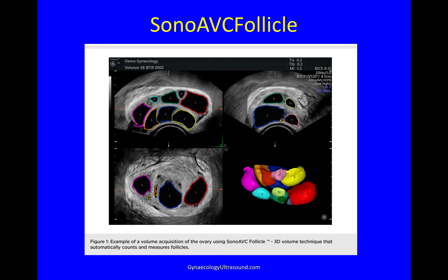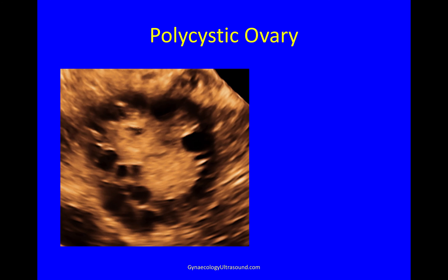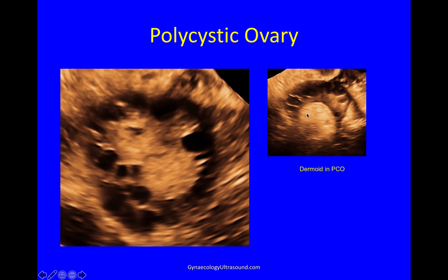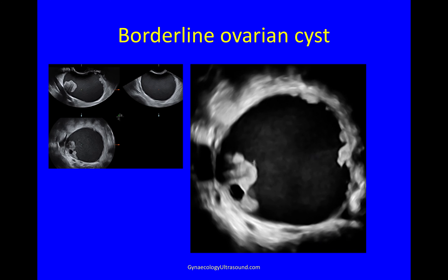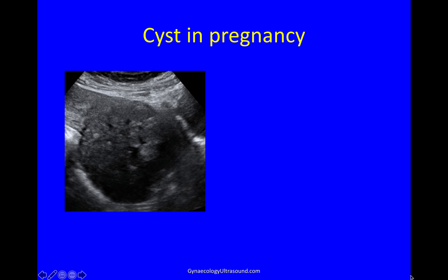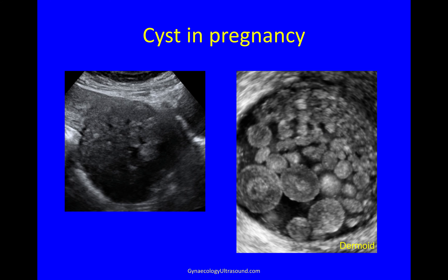3D is useful for antral follicle counting — you can measure and count follicles using SonoAVC technology. This is what a polycystic ovary looks like on 3D ultrasound, with more than 20 follicles visible, giving a diagnosis of polycystic ovary. This is a dermoid in a polycystic ovary. For characterization of adnexal masses 3D is not the primary tool — 2D with the IOTA classification system gives you the answer — but 3D can reveal additional detail, such as in this borderline cyst where a large papillation and widespread wall irregularities are seen. In a case of a cyst in pregnancy, 3D clearly confirmed it to be a dermoid.